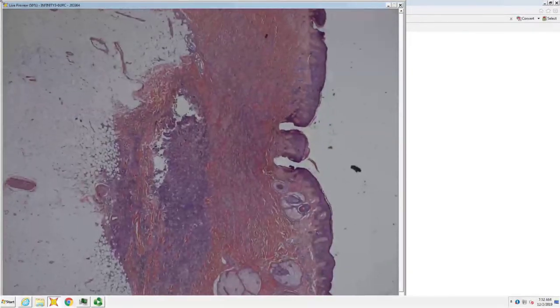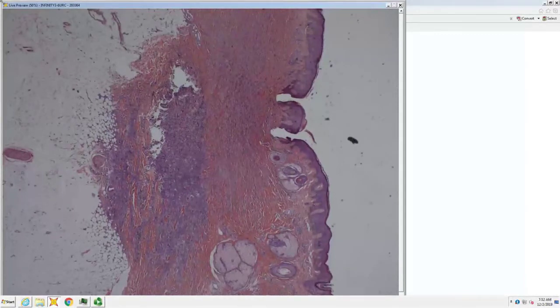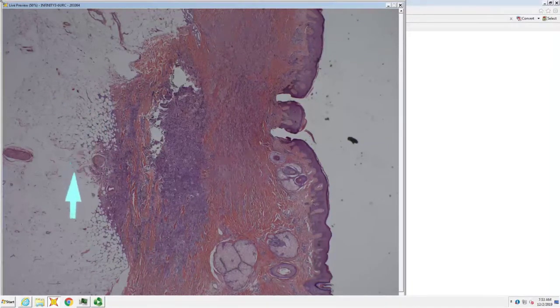All right. So from here, looks like platelike acanthosis. What does that collagen do, wrapping at the periphery? So a dermatofibroma. First off, you're allowed to have a little fine lacy extension of DF into the fat. In fact, that's exactly how DFs extend into fat. So it's not the parallel rows like strata or layer cake that you get with DFSP. It's just a uniform, lacy involvement of the superficial fat that's completely normal and expected for dermatofibroma.